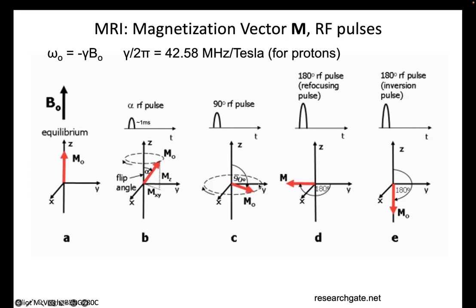And as I said last time, this is a bit of a fairy tale, what is going on here, that we have this magnetization vector. This is in fact protons undergoing a transition from the higher energy to lower energy states, and they're doing that in phase, causing a signal in your coil. But the really nice way of modeling it is adding them all up and calling them this magnetization vector, and then characterizing its precession in the transverse plane.